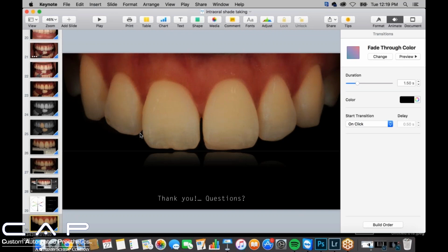So, dehydration is definitely an issue. When all that moisture is gone and it's dried out, you definitely get different values and different chromas and different opacities. Everything changes.